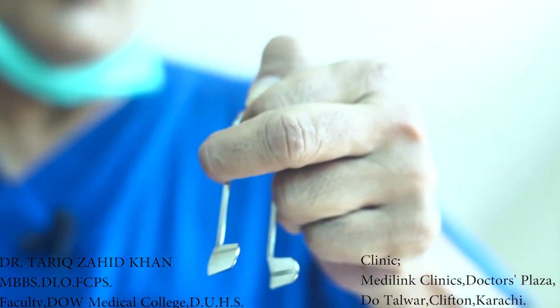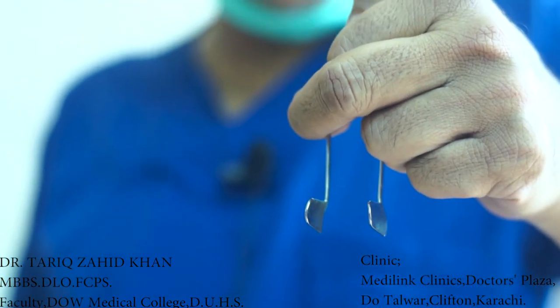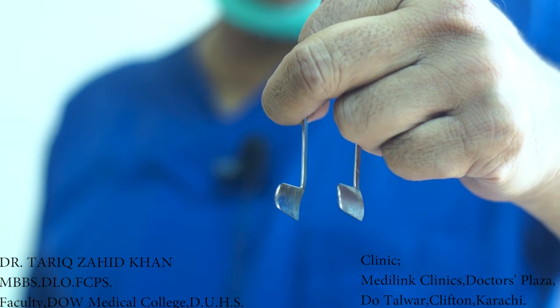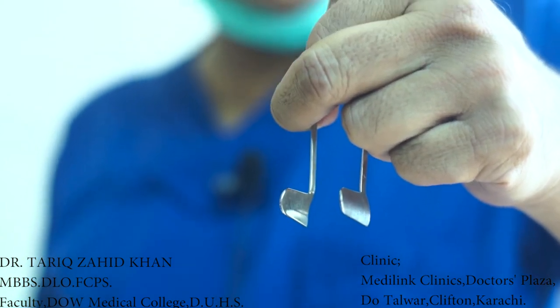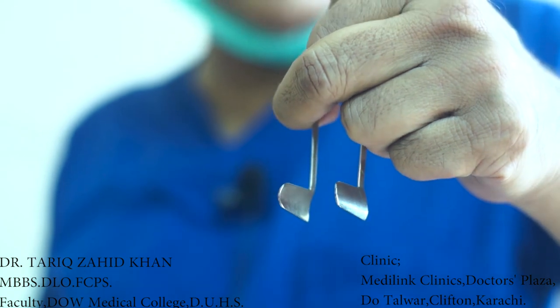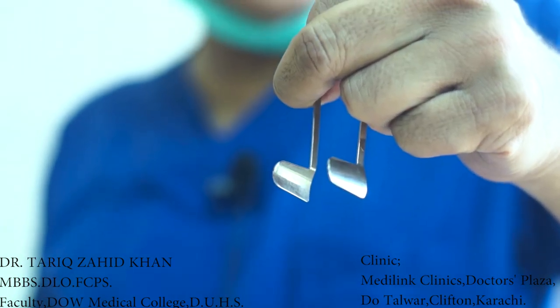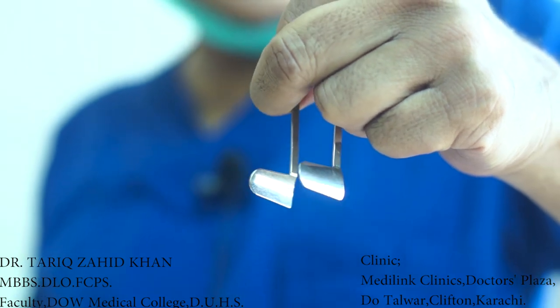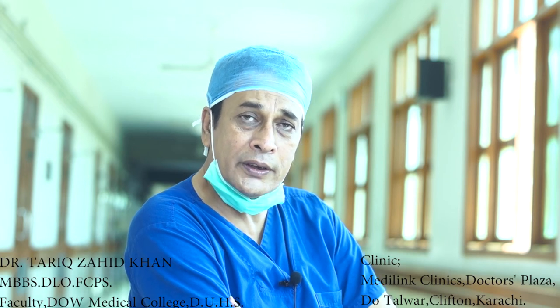The structures you will examine during anterior rhinoscopy would be: medial wall, lateral wall of the nose, roof and floor of the nose, vibrissae, turbinates, and any discharge. You will also perform a probe test during this examination. On the medial wall, you will appreciate the nasal septum for any perforation, deviation, crusting, polyps, hematoma, and abscess.